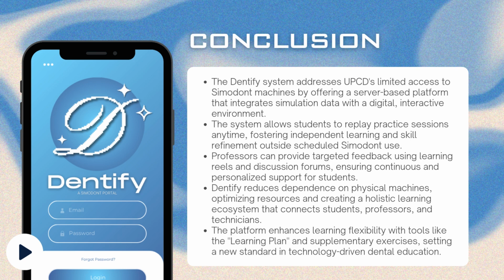The Dentify system addresses the limitation of having only 3 Simodont machines at UPCD by providing a server-based platform that integrates simulation data into an accessible, interactive digital environment. This platform allows students to replay their practice sessions anytime, fostering independent learning and skill refinement outside scheduled machine use. Professors can provide personalized feedback through learning reels and discussion forums, ensuring continuous support for students.